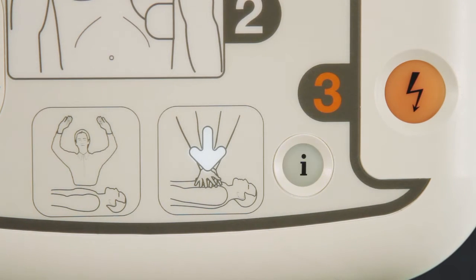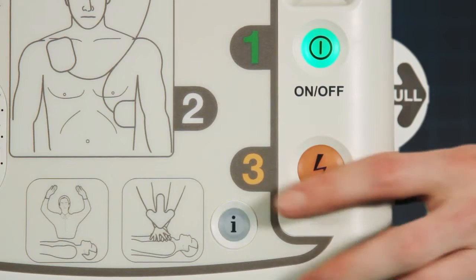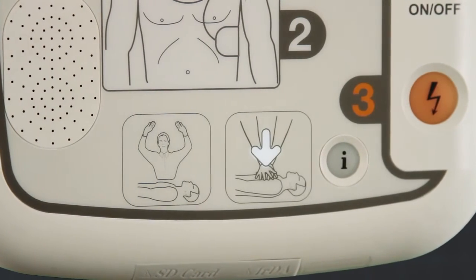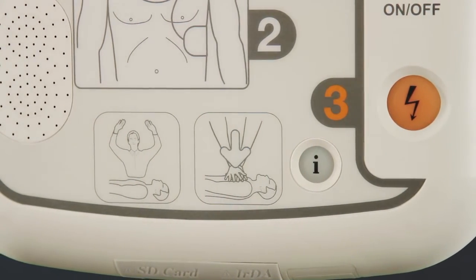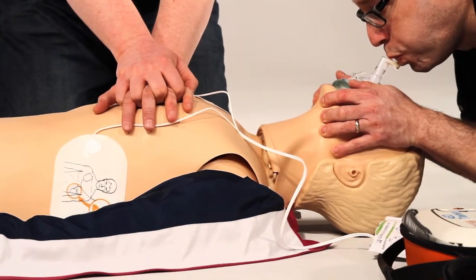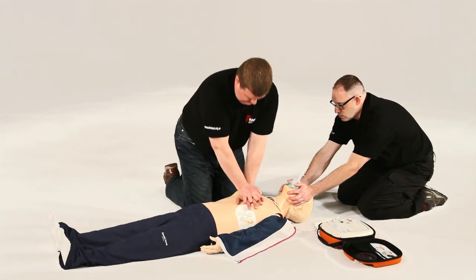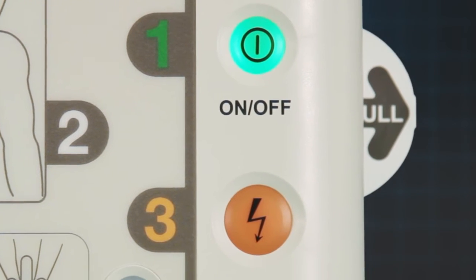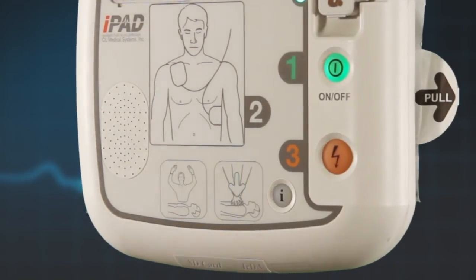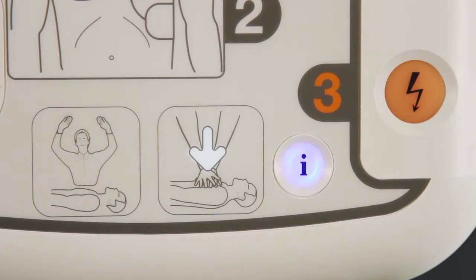The iPad SP1 AED will then prompt you to commence CPR. If you press the flashing blue I button, the AED will commence with CPR voice prompts. This includes a metronome for compression rate and a verbal command for when to breathe for the patient. If you choose not to press the flashing blue I button, the iPad SP1 will verbally tell you how long until it reanalyses. The AED will also detect if CPR has been performed, and will instruct either to commence CPR or encourage you to continue CPR.